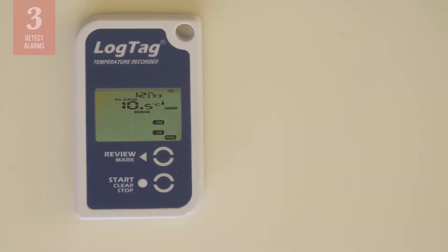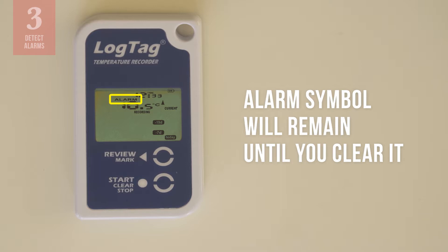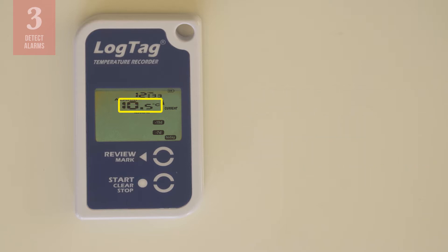When the log tag alarm is triggered, you can see the word alarm on the display. This alarm symbol will remain until you clear it, even if temperatures go back within range. Here, you can see that temperatures are still too high — it is 10.5 degrees Celsius.